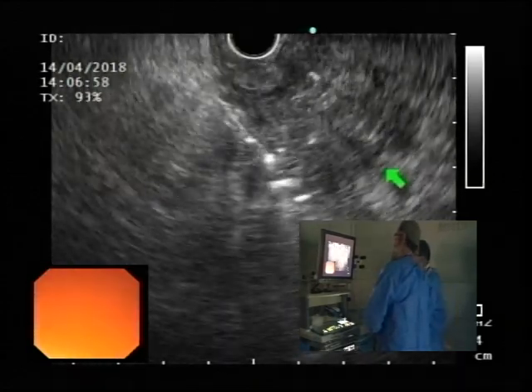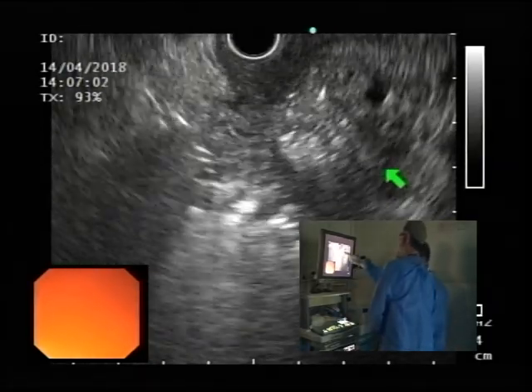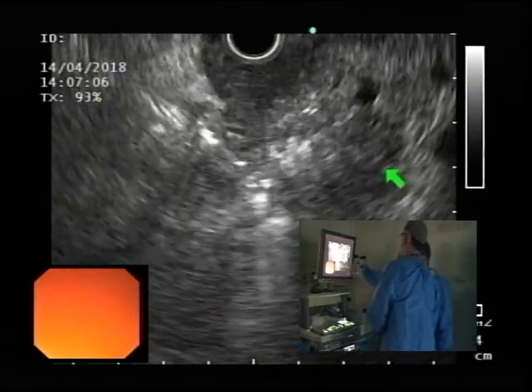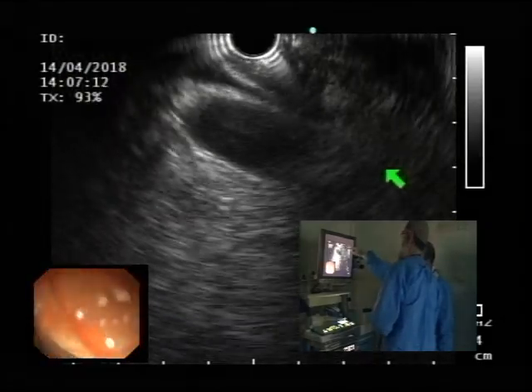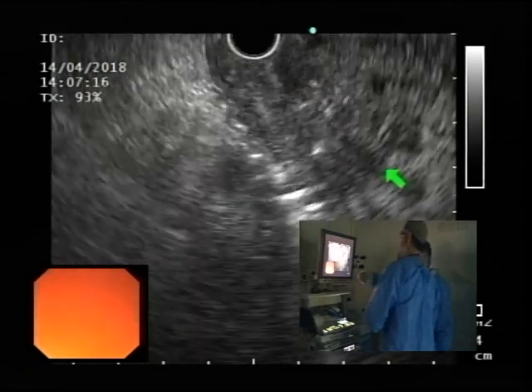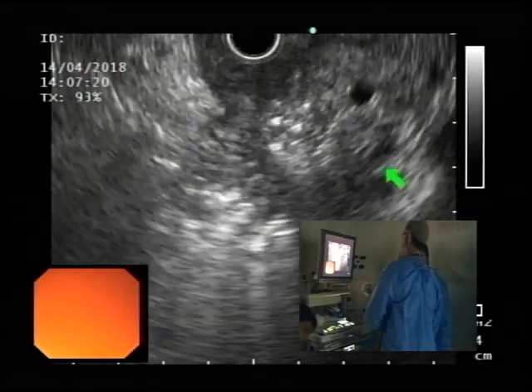So you have to do this constant movement back and forth. Clockwise, that's your necrotic mass, pancreatic duct, going duodenum, that's duodenal wall. Now go counter, and you should see bile duct, this right at the top. That means now go back clockwise because it will stabilize you. And now pull back a bit more. Pull back a bit more, tiny bit more.